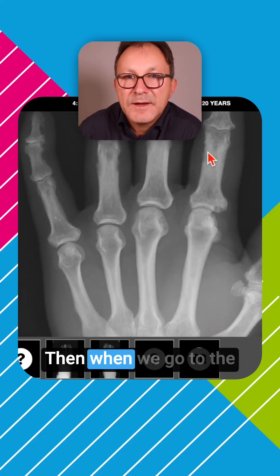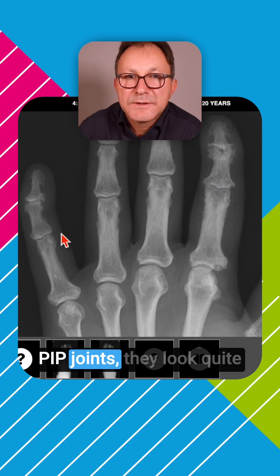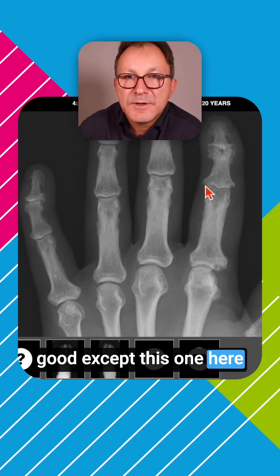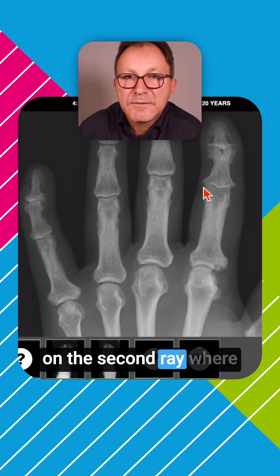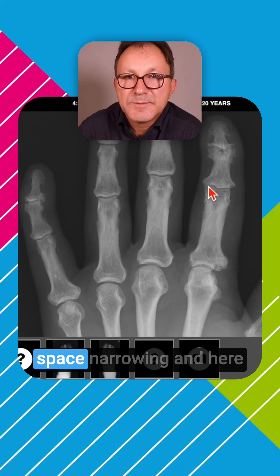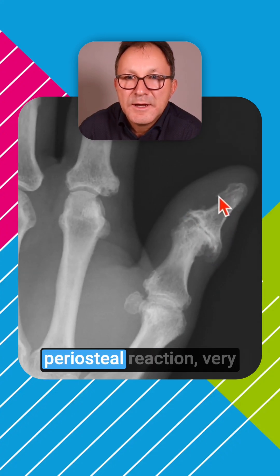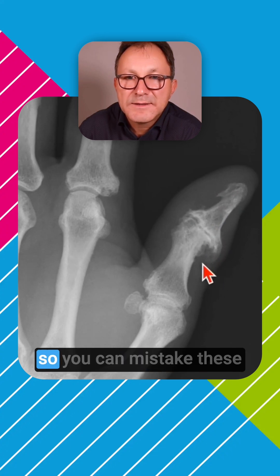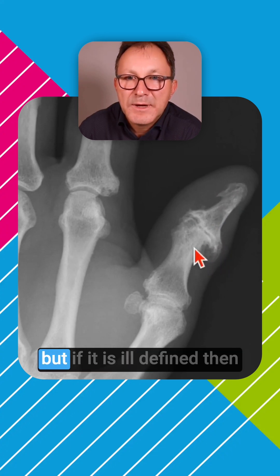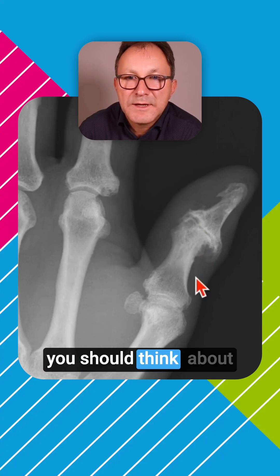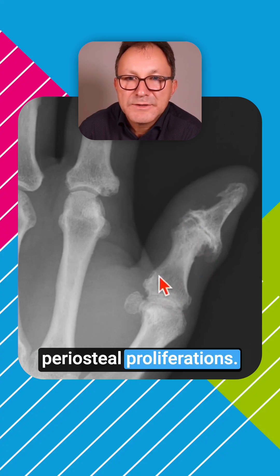Moving to the PIP joints, they look quite good except this one on the second ray, where we see joint space narrowing and a very severe periosteal reaction — very large osteophyte-like outgrowths. You can mistake these changes for osteophytes, but if they are ill-defined, you should think about psoriatic proliferations.